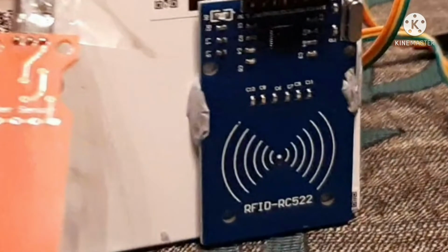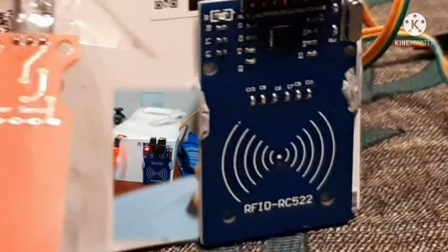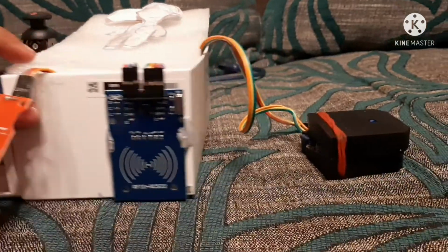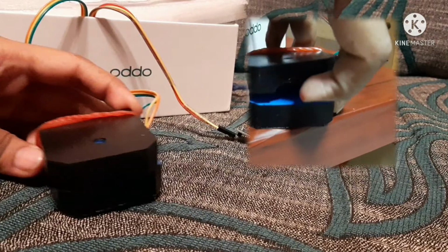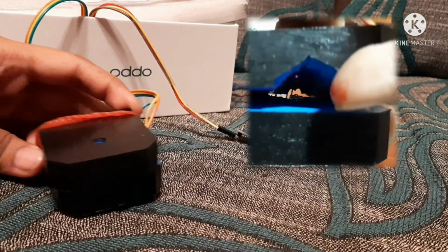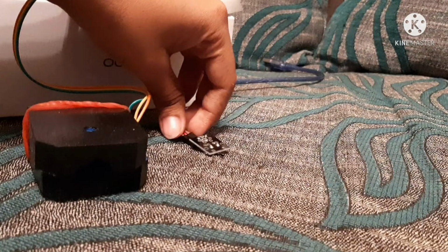The RFID sensor, which is also set at the bottom side of the bed, will check for patient's ID tag and healthcare employee's card. On the left side of the bed, there is a heartbeat sensor which monitors patient's pulse rate. There is also a temp sensor which monitors patient's body temperature.